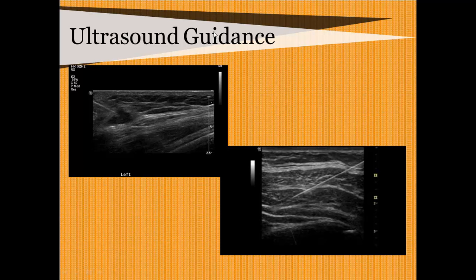So here we have the needle coming into a little mass. Okay. And they're going to take out, in this case, some tissue, put it into formalin or some other kind of liquid to preserve it, and you're going to send that off to the lab, and they're going to come up with a result from that in a couple of weeks. Here we're administering medication. This patient's having pain, so you want to inject some steroid in there.